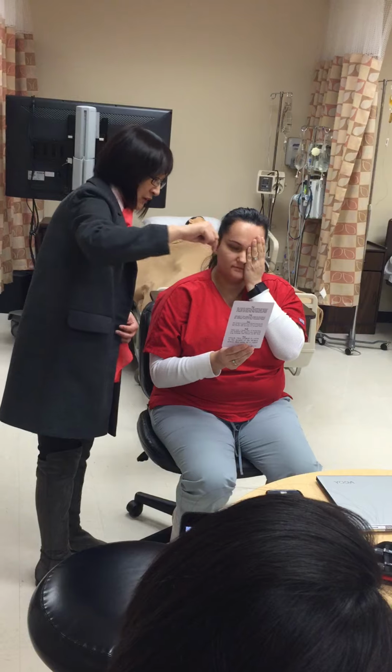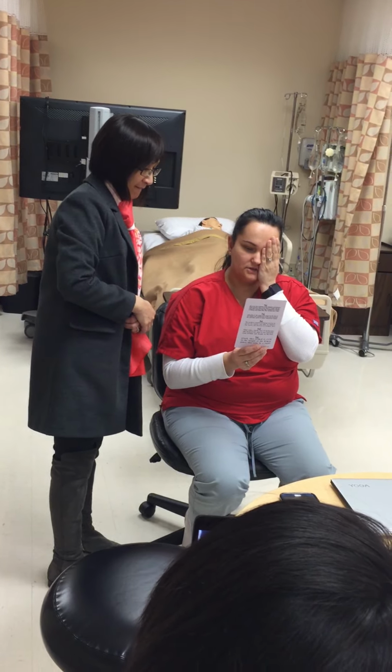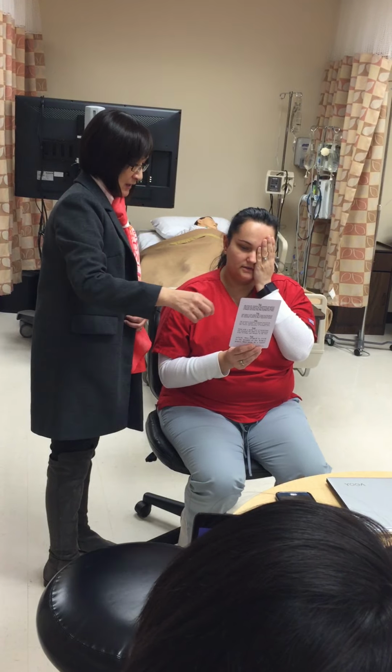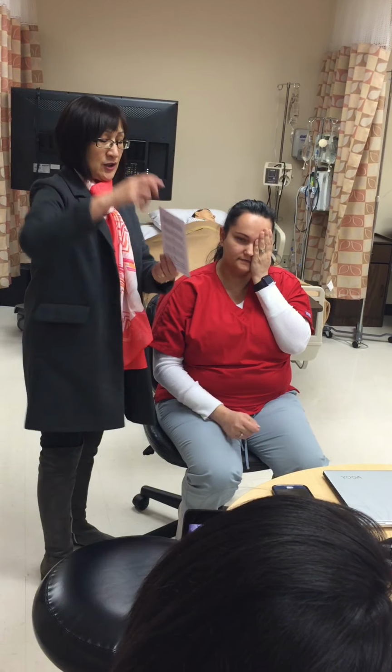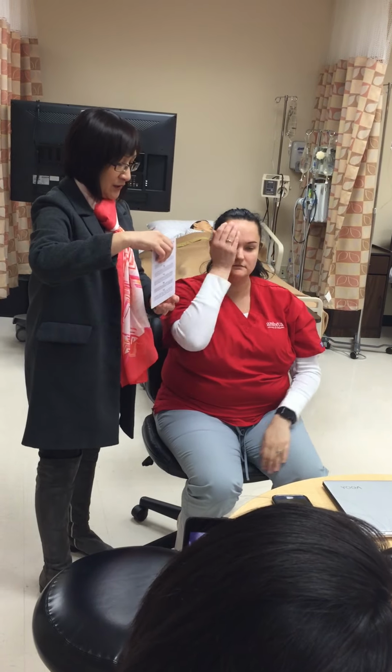Which number can you read? I can read number 1. Just read one, in the first, second line. Century of the Christian era, the Empire of Rome comprehended the... So she can read this top here. Now we check the other eye.